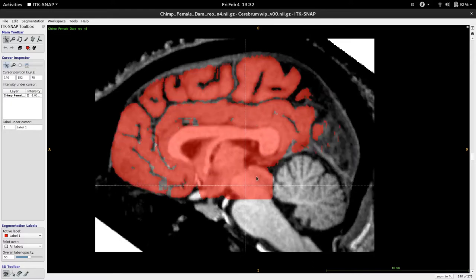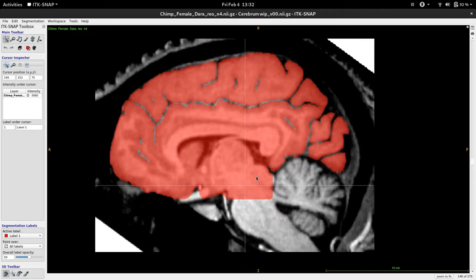This is just how I do it, it's not written in stone, it can be changed, but I find this principle easier over time. So I look at the axis of the brainstem, this line, and then I locate the inferior and superior colliculus, these two bulbs near the cerebellum on the back of the brainstem. Then I look at the superior part of the superior colliculus, and I imagine a parallel line, something like this, orthogonal to this brainstem axis, and I try to cut in a consistent way.